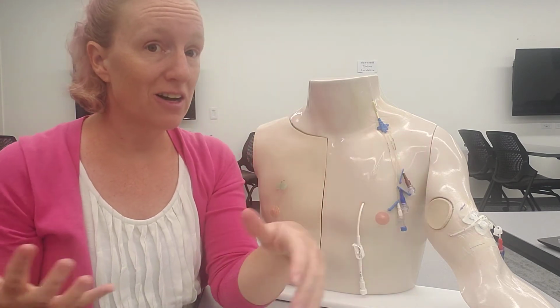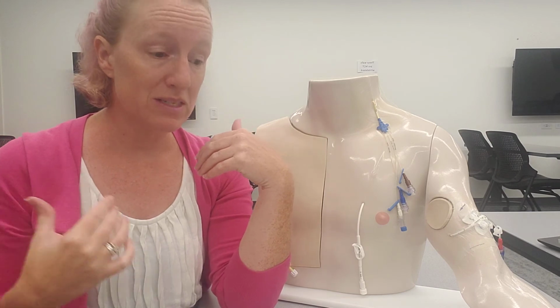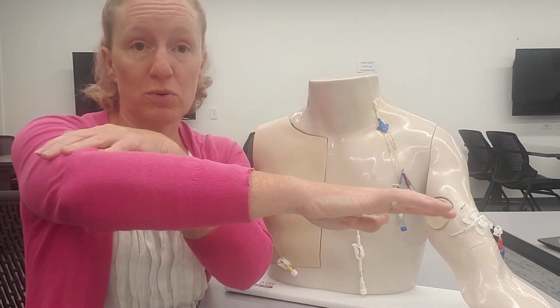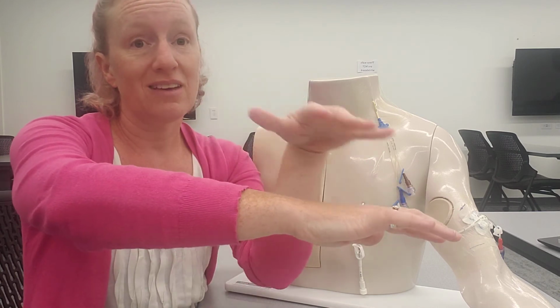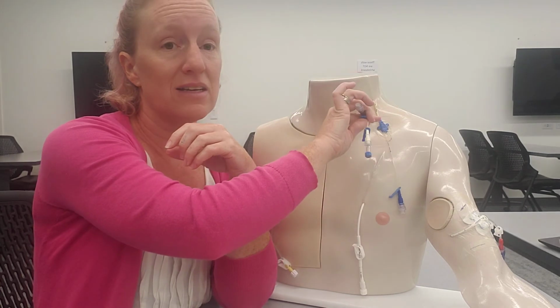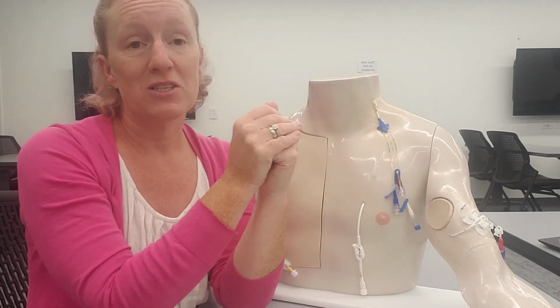Hopefully this helps with just a little quick crash course on IVs. Remember, it's all about the tip. Is the tip in the center of the chest, or is it out in the peripheral? LPNs can do stuff out in the peripheral. They cannot initiate access in that central line. That's just how the scope is written at this time.